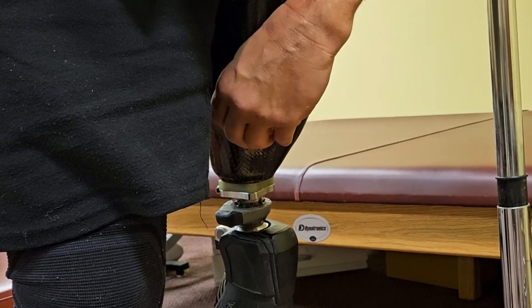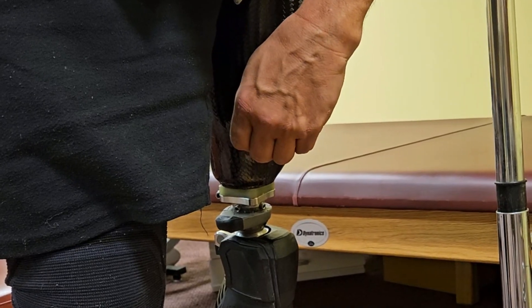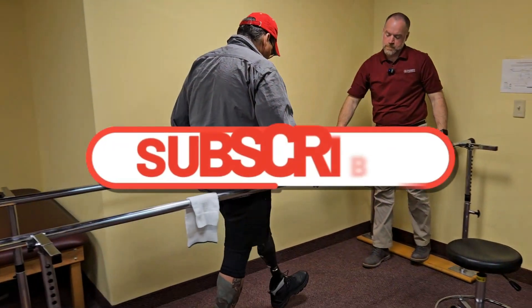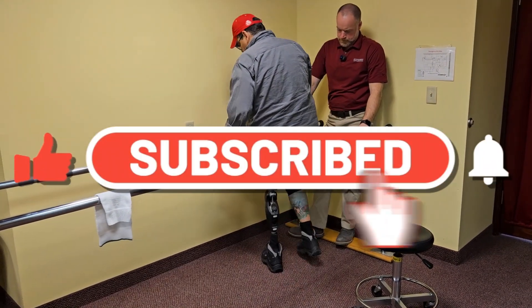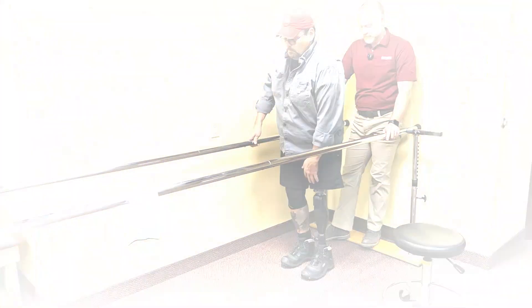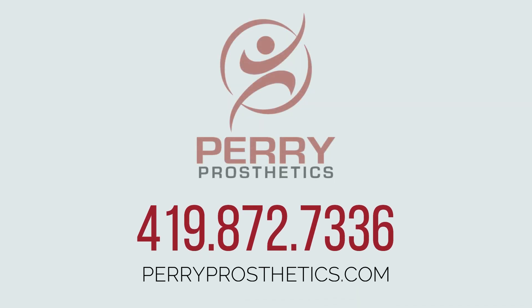Remember, always finger-tight only. The team at Perry Prosthetics is always available to answer questions from patients, family members, and medical professionals — contact us at any time.